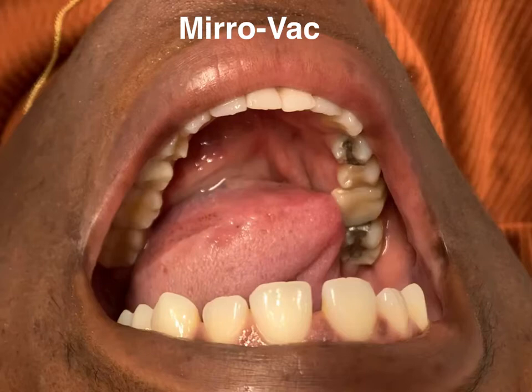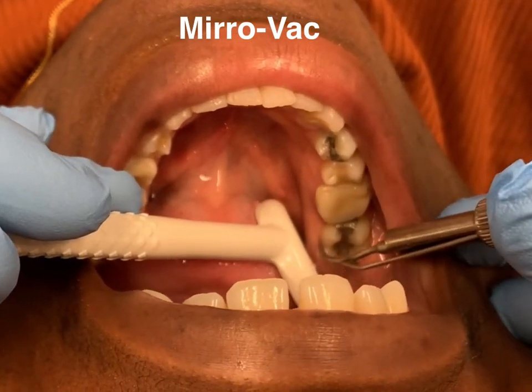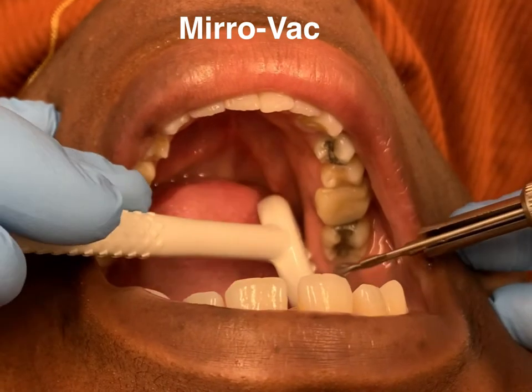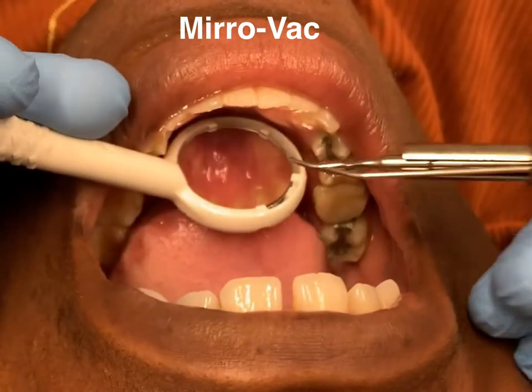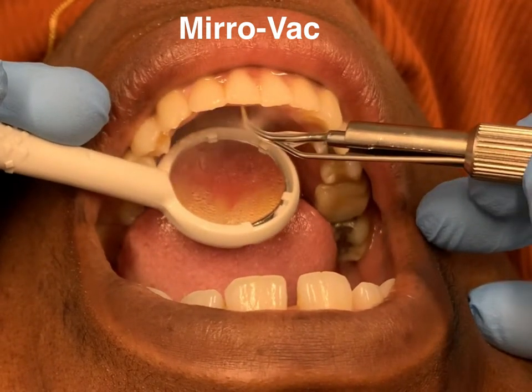This is the Mirro-Vac. So we're doing the lower right and the anteriors. Even though the Mirro-Vac does have holes on the face of the mirror, it doesn't really suction that well there. I think part of it is the design itself of the mirror, but you don't have the same volume of air and vacuum coming through to really take in aerosols and suck the stuff in.